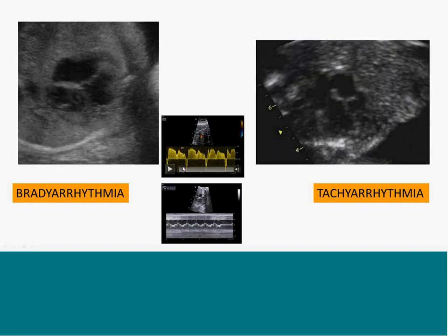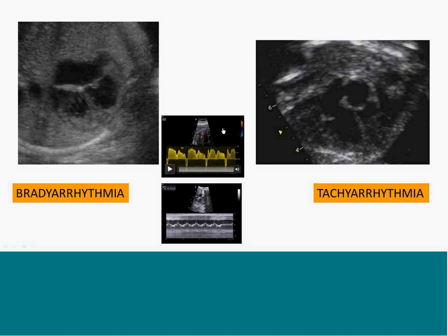Dopplers to decide what type of arrhythmia you have, and also Dopplers to understand whether you have any evidence of heart failure. Now here you can see this is a ductus venosus Doppler. Normally it will not have such significant flow reversal. These are negative waves and these are significant flow reversal. This you can get in hydrops, but you can also get it in heart block, where the atria are pumping and the AV valves are closed. So do M mode to find your atrioventricular association.